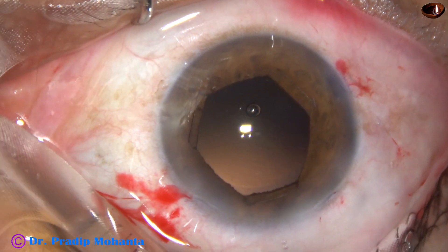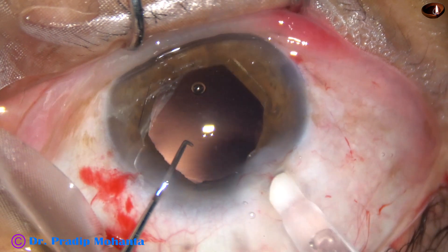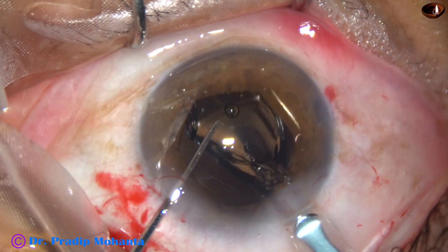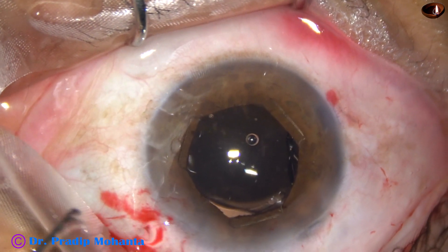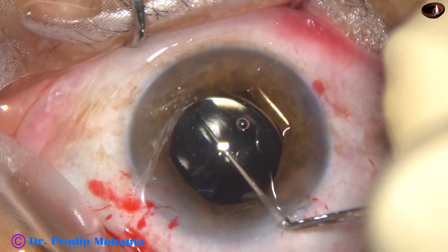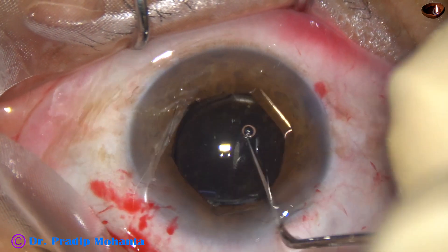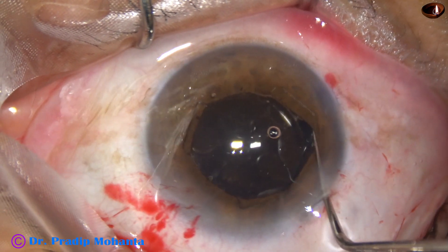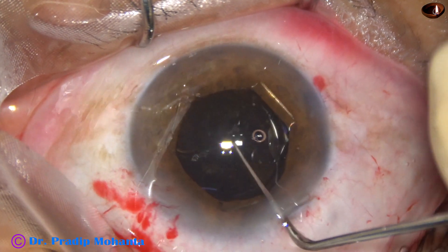I inject some visco and implant a single-piece monofocal intraocular lens in the capsular bag. The lens has gone into the capsular bag. Dial the lens and place the haptics about 90 degrees away from the main incision so that I can go behind the IOL and remove visco nicely from the capsular bag.